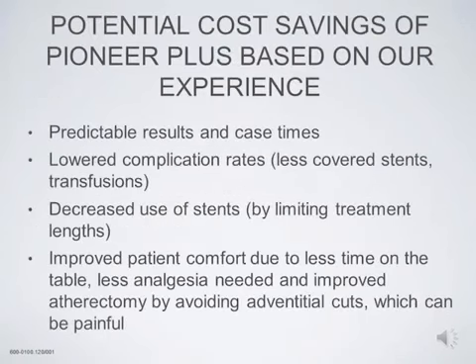What are the benefits? Certainly cost savings, I think, are significant. You get predictable results in case times. It certainly lowers case times as it improves crossing times. You have lower complication rates, such as what we've seen here, with the sub-adventitial crossing causing an aneurysm.